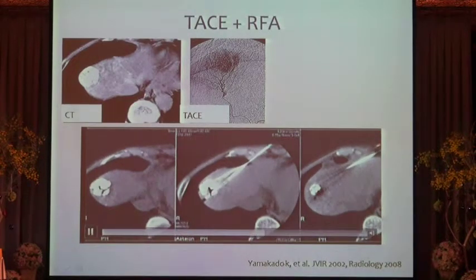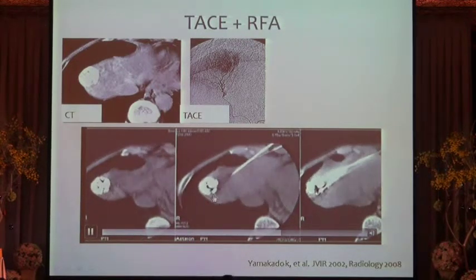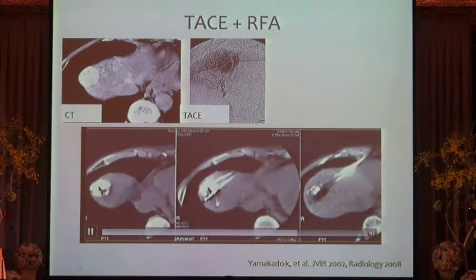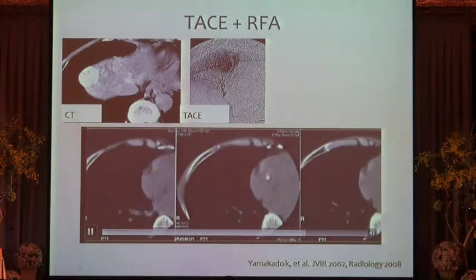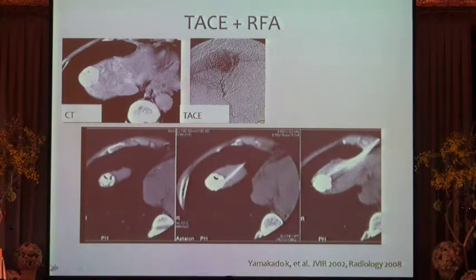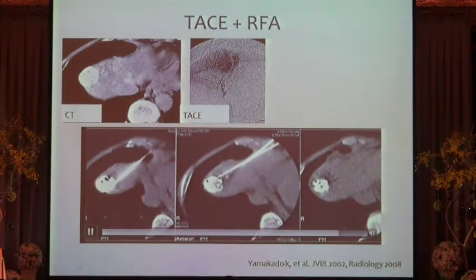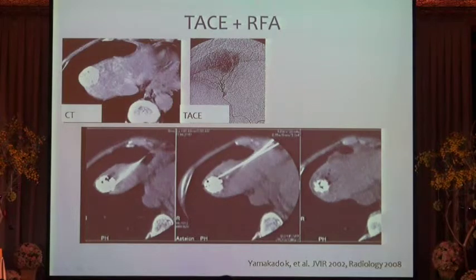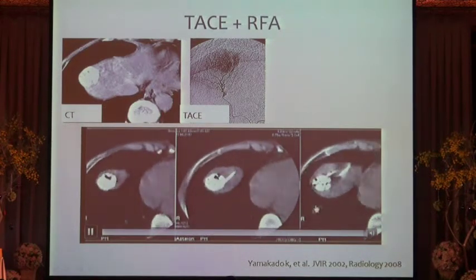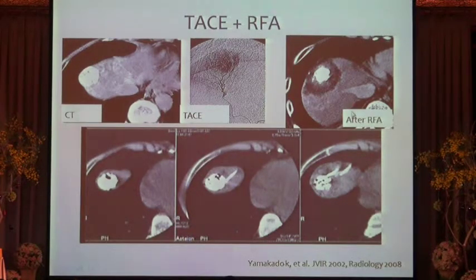Now you can see a bubble formation in the backside of the tumor. The heart is beating. Yeah, you can see bubble formation, and the heart is beating. And now we are moving the table from the head side to the foot side. Then you can see a bubble formation in the front side of the tumor like this. And now you can see bubble formation in the entire tumor. And you can expect good results on the follow-up CT like this.